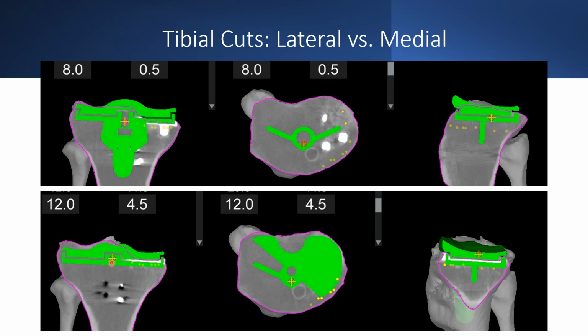I can't just make a straight cut because I'll be sacrificing too much healthy bone on the lateral side. So I know we want to plan for 8 millimeters here, but I know I have to drop this at least 4 millimeters to get to healthy bone. Now augments come in 5 and 10 millimeter increments, so I'll drop it to 5. I'll take 1 additional millimeter on this side so I can get to healthy bone. So over here we'll cut 8, and over here we'll cut 5. So we'll do this in 2 separate stages, and I'll show you how that's done in real time.